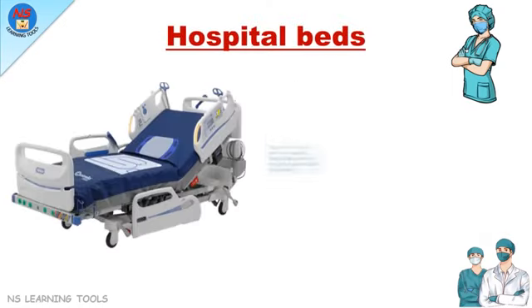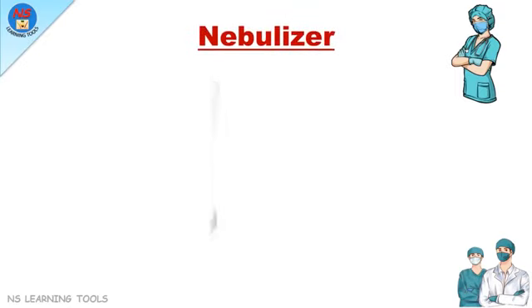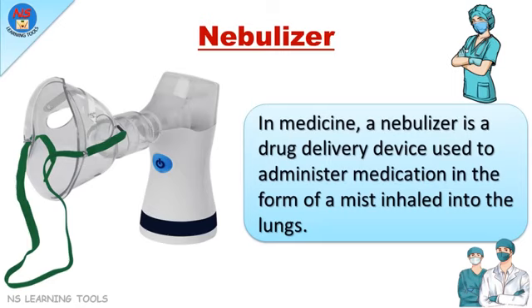Hospital bed. Hospital bed is a bed specially designed for hospitalized patients for the comfort and well-being of the patient. Nebulizer. In medicine, a nebulizer is a drug delivery device used to administer medication in the form of a mist inhaled into the lungs.